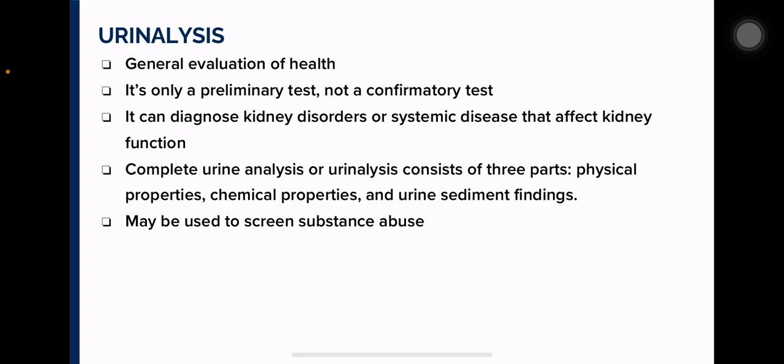Now let's proceed to urinalysis. It is a general health evaluation and often the first test physicians use because it's simple, inexpensive, and non-invasive. But take note, it's a preliminary test and not confirmatory. So a complete urinalysis has three components.